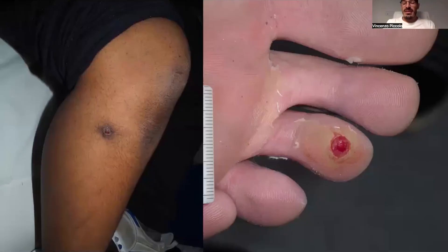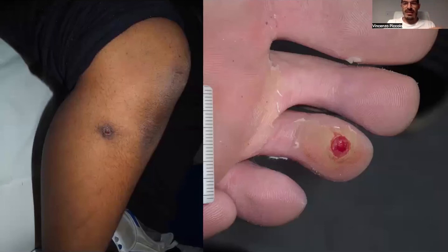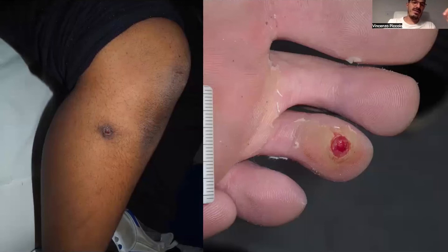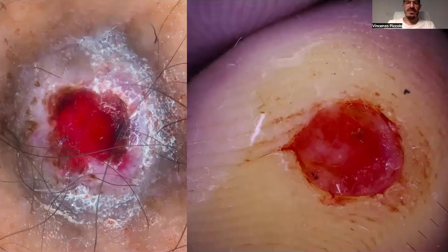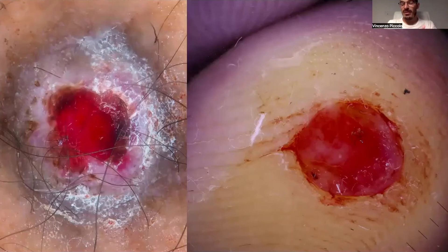Here is another very striking example where we have two ulcerating nodules: on the right, an ulcerating nodule of the plantar area, and on the left an ulcerating nodule of the leg. At dermoscopy the findings look very similar — a central red lacuna with peripheral collarette.